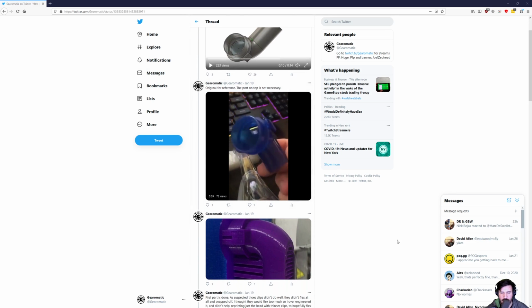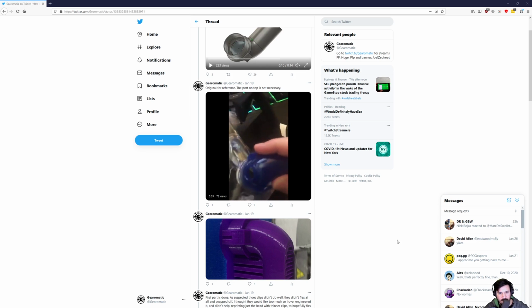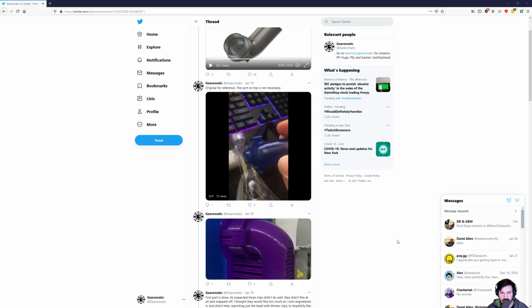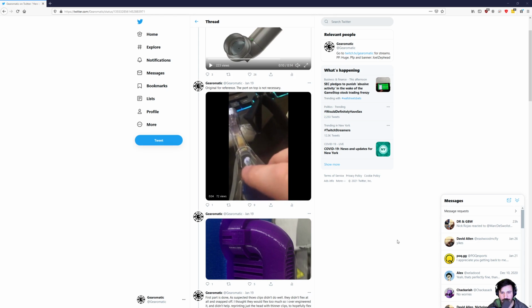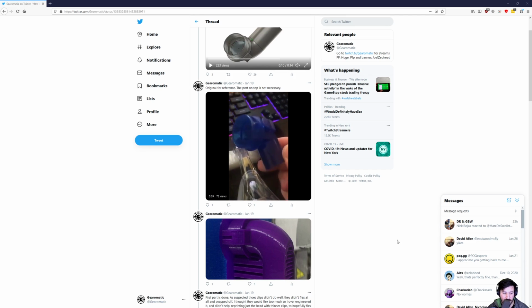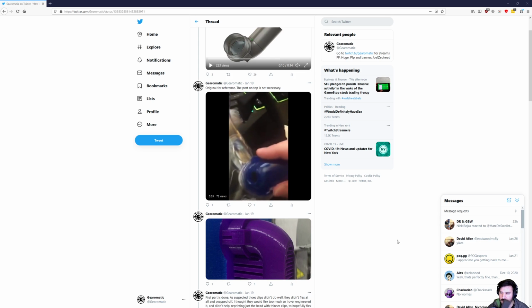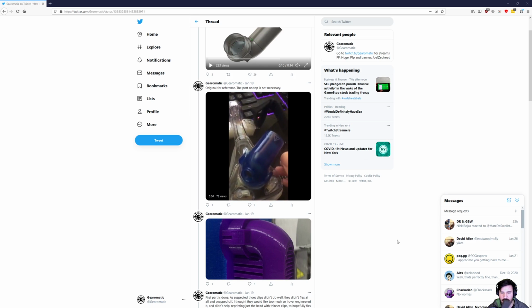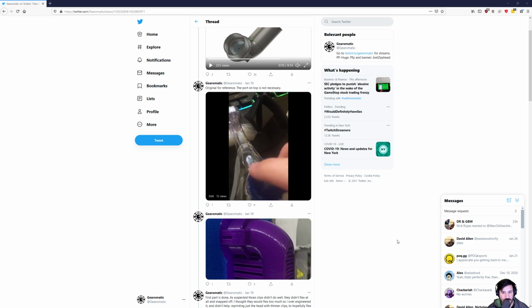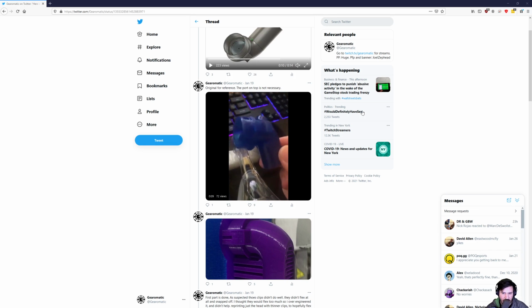Like I said, this is the original part. I'll show it clicking into the mask in a second. The goal is to recreate this part functionally, minus that port on the top. That was unnecessary, I was told. And to get it to a point where it could be printed, in case or when these start being hard to get. From what I'm told, they're getting hard to get. They're not impossible to get right now, but it's something that if they don't have, that may mean they have to turn people away, and that's not a good thing. So, like I said, I made this Twitter thread.